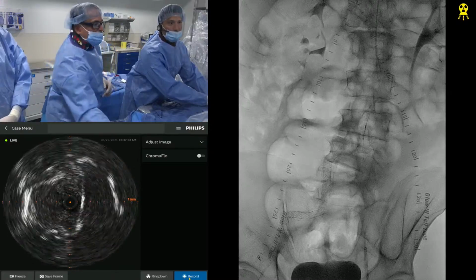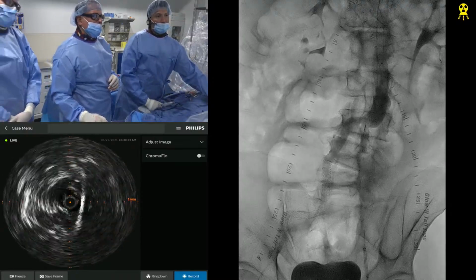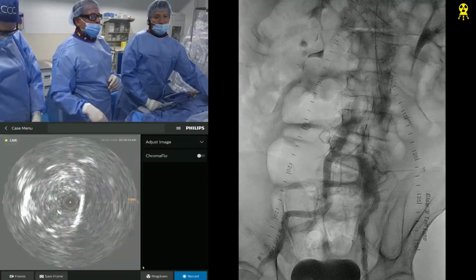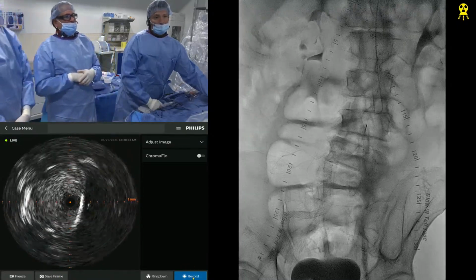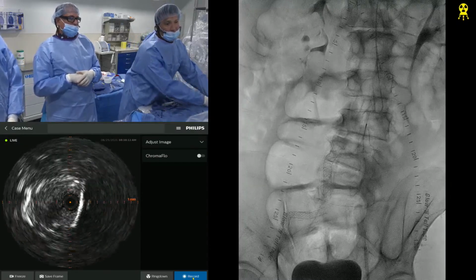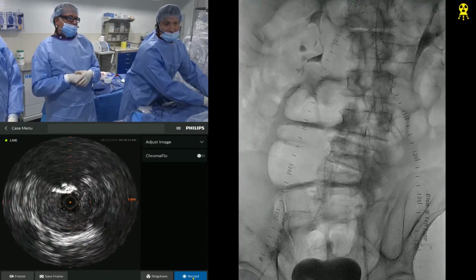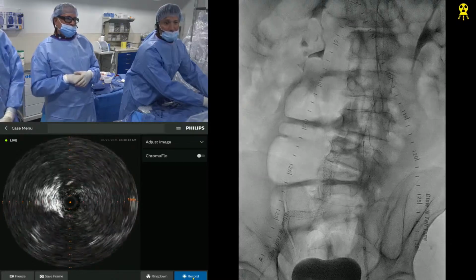I want to take a quick picture there. It's pretty much right at the ostium of the iliac. You can see that there. Measure, 9 millimeter vessel. Yep, 9 millimeter vessel or so. But come back now. Let's do the whole external iliac. The problem will be landing the stent distally. The vessel is very aneurysmal distally, right here. So we might have to take a shot.